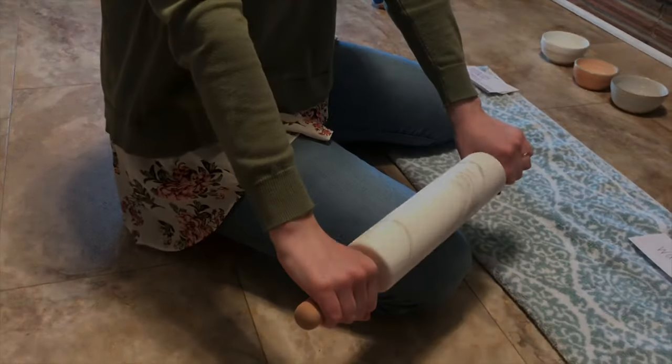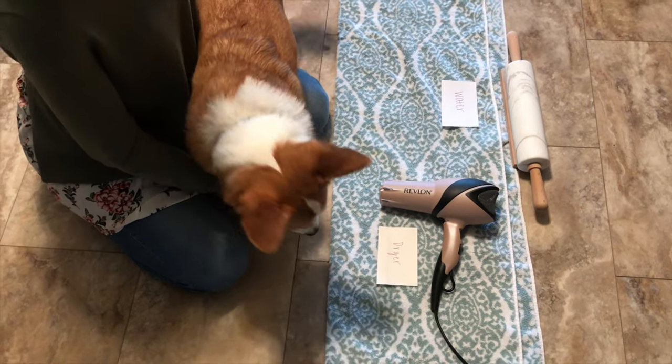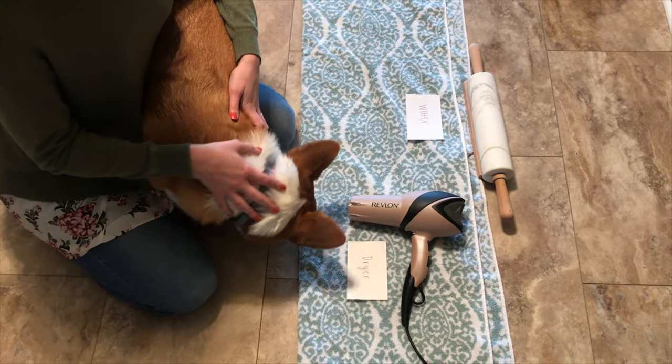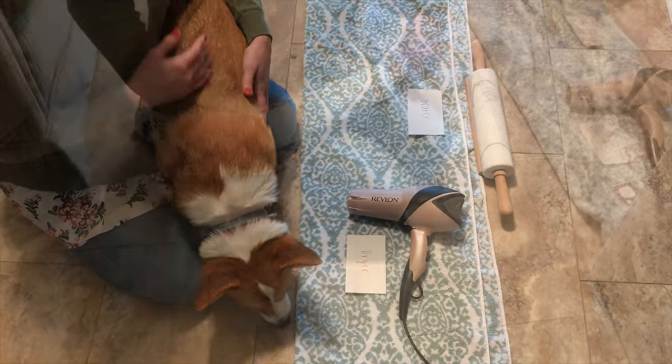Then we're going to roll into the dryer next. After it is rinsed off in the water, it'll go to the dryer to dry it off. I won't actually use it on him because he is deathly afraid of blowdryers.